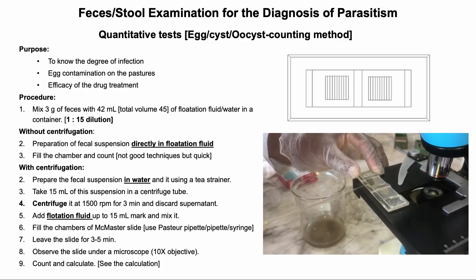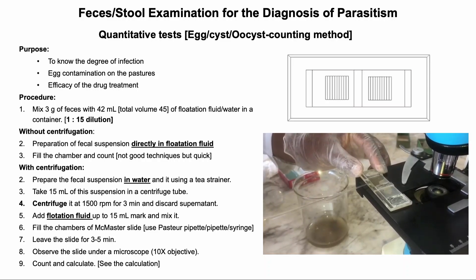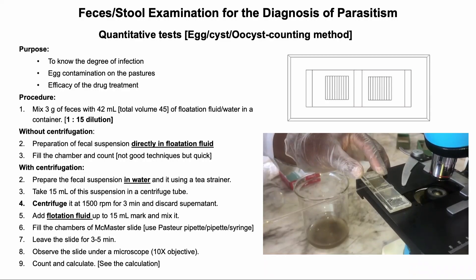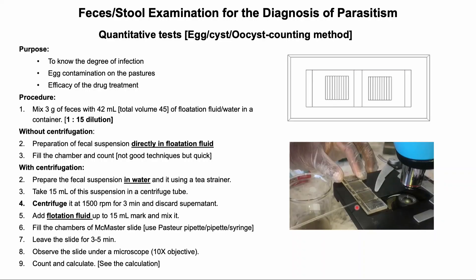Then immediately fill each chamber of the McMaster slide using a Pasteur pipette or syringe. Remember to fill the entire chamber, not just the area under the grid. If large air bubbles are present, remove the fluid and refill. Allow the slide to sit for five minutes so that eggs can float. Examine the slide at 10x objective and count the eggs or parasite stages in each lane of each chamber. Each type of egg, cyst, or oocyst should be counted separately.